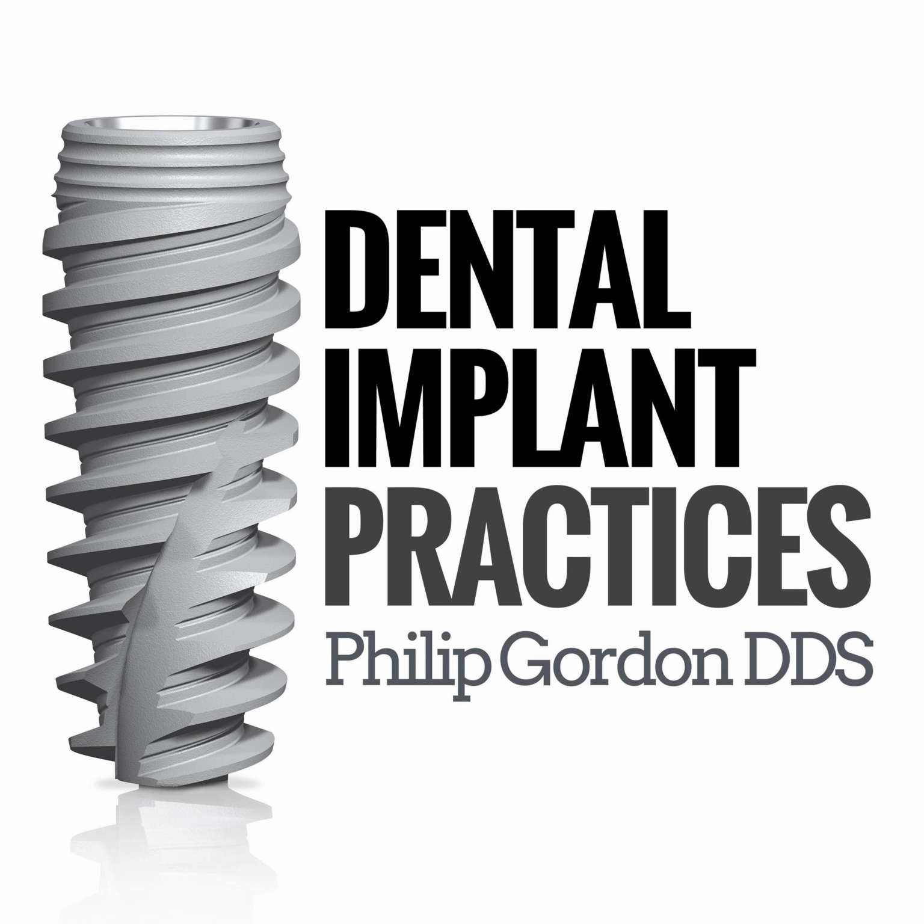Sure. So with the NSequence guided prosthetic, where you have someone who's terminally dentate, we've got to get all those teeth out of there. We talked about the initial records, of a 1, 2, 3 guide, as we call it. A couple, 1 implant. There's one other thing we're going to need with the NSequence guided prosthetics, and that's the photo series as well. We have it on our website, so you can print it out. It comes in the new doctor packet, like you said, so you can see what photos we're looking for, because we don't have the opportunity to have the patient in the lab with us.